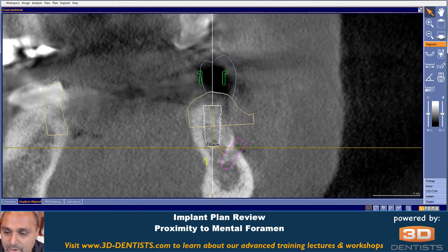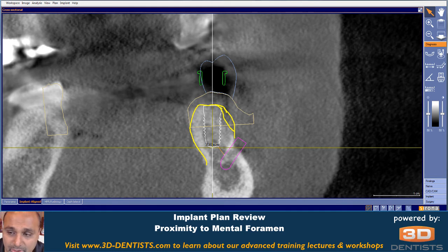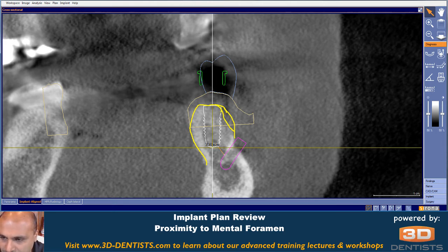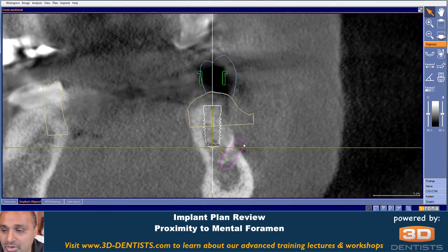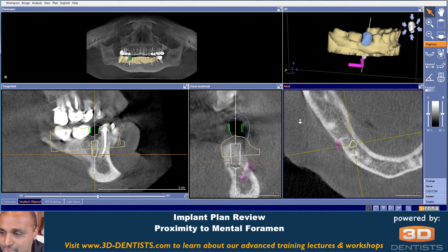The next thing I wanted to point out is I'm having a hard time discerning the buccal plate. Does it come in like this? If it does, the other thing I'm looking at is the likelihood of needing to do some type of bone augmentation here due to either thread exposure or thinness of the bone and likely future thread exposure. Needing to do that augmentation also requires lifting a flap, and more than likely I'm going to need to lift my flap in this area and potentially create some damage here. Not that it can't be done or shouldn't be done, but one of the things I'm taking into consideration is the risk that this presents.